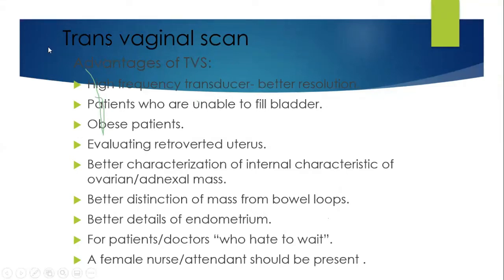Now, what are the advantages? This is a high frequency transducer. As I told you in the beginning, this ranges between about 7 to 12 megahertz. Definitely, it has a very good resolution. But then depth is a problem.